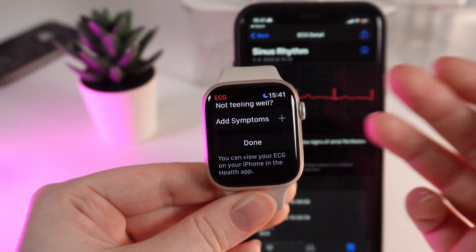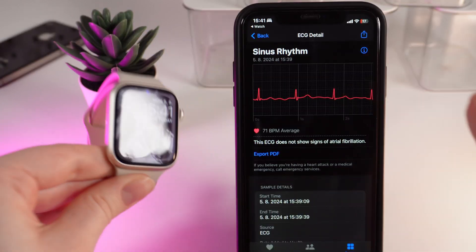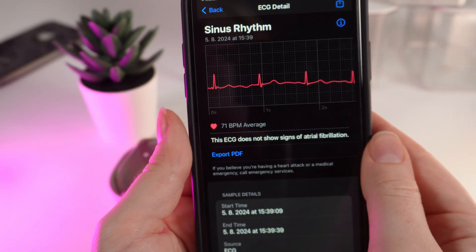Click save, and after you are done just simply click done, and the ECG recording will be saved on the Apple Health application on your phone.